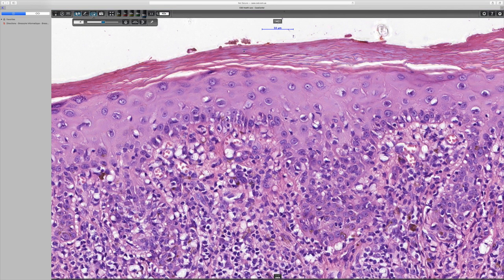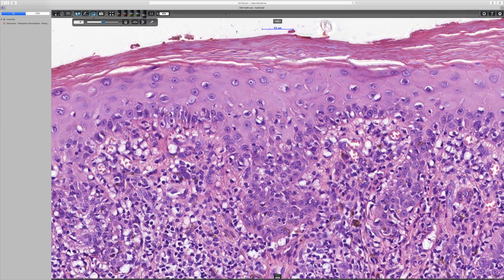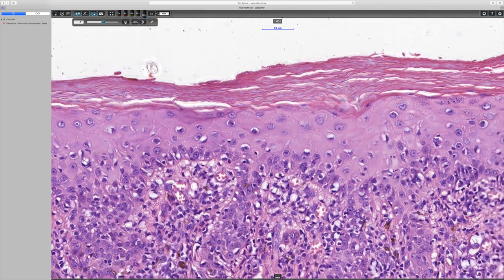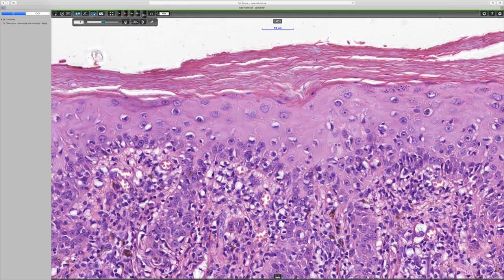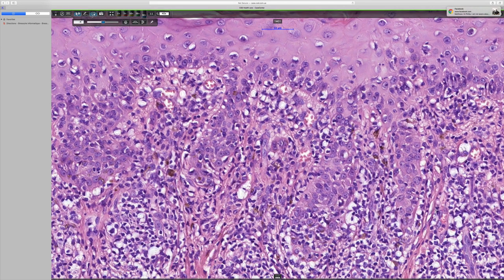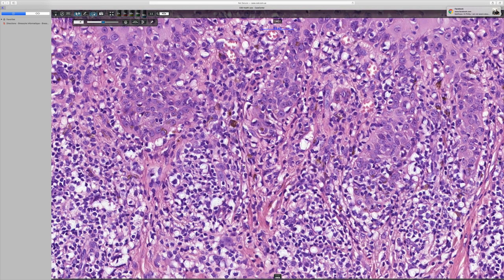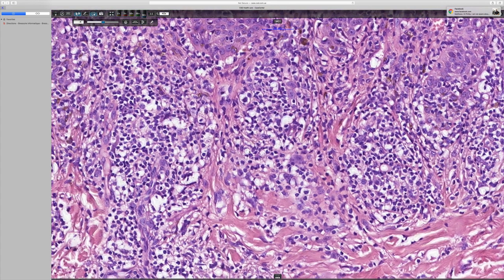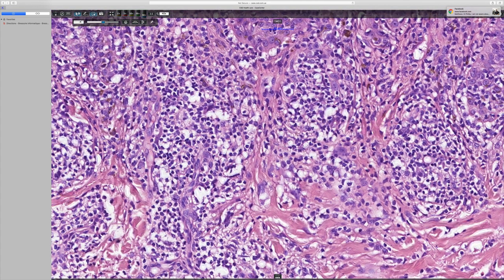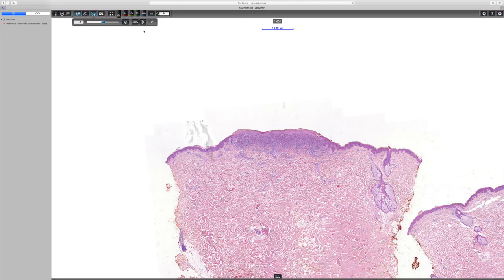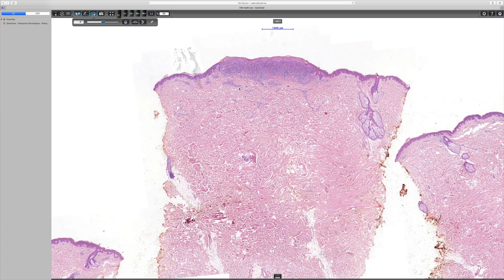There is a single remnant nucleus there — and another one there — so one can say this shows just a hint of parakeratosis, though perhaps that's stretching things a bit. In summary, particularly with the clinical history of a solitary lesion, I think we can interpret this as a lichenoid keratosis.